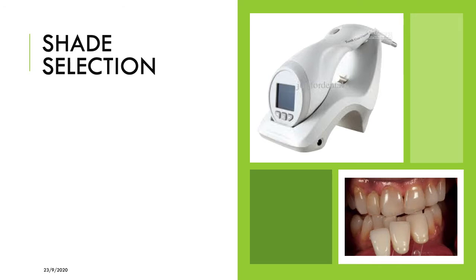It's so easy to do, but at the same time it might be expensive, and whatever shade it gives, the work you are giving to the laboratory has to be done with the same Vita shade guide. Coming to the normal one, how you do the manual one: make sure the tooth is free of any saliva and water, and the tooth should be at the level of the dentist's eye. Using the normal Vita shade guide, you can compare the tooth and the color, and finally you come to a shade and you can select it there.